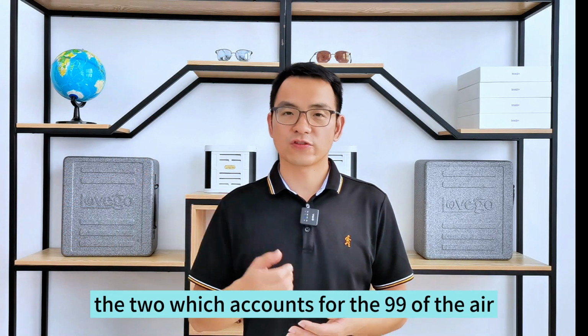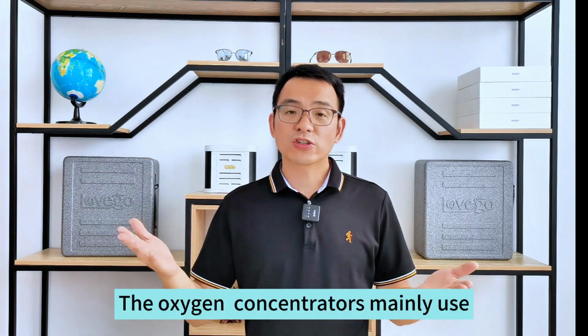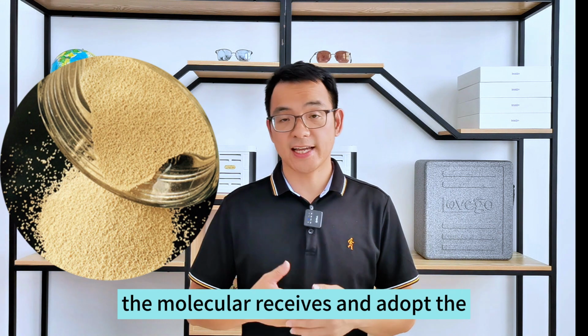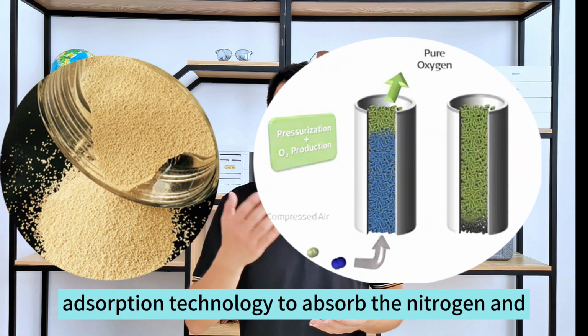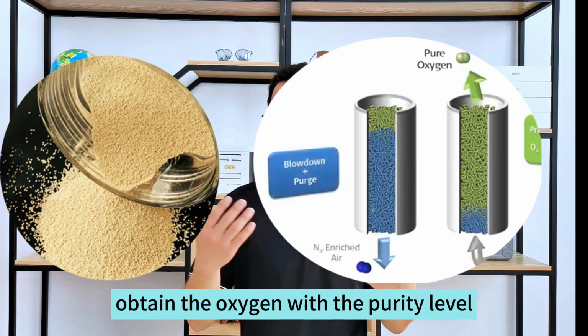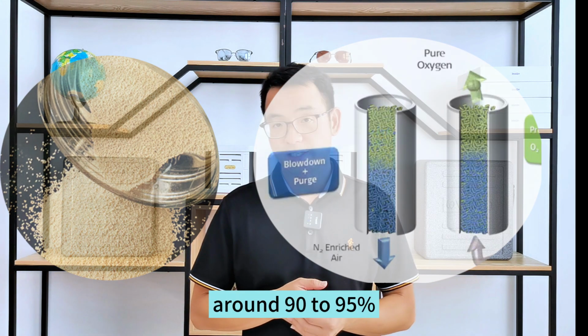The two account for 99% of the air. The oxygen concentrators mainly use the molecular sieves and adopt the pressure-swing adsorption technology to absorb the nitrogen and obtain the oxygen with the purity level around 90 to 95%.